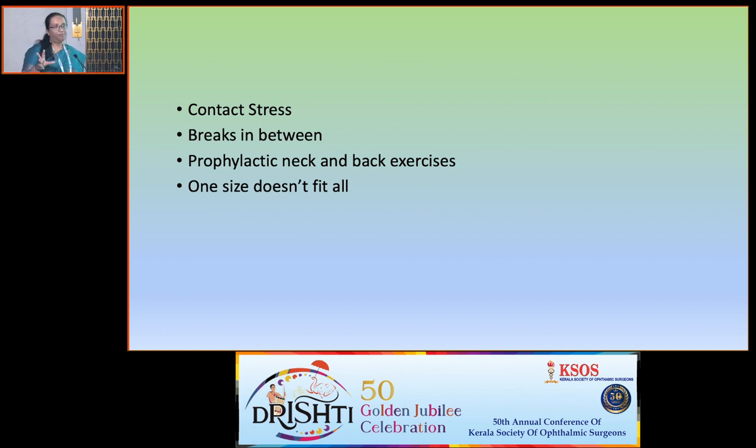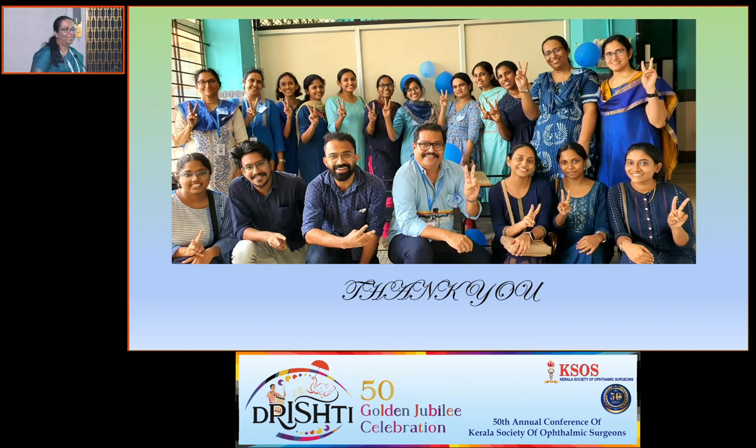And one thing is, since we are really promoting the industry, we can say that one size doesn't fit all. We have tall ophthalmologists, we have short ones. We can have different types of instruments for us. They don't have to give you one slit lamp and then we have to adjust it. We can tell them that we need different designs, depending on you. Thank you so much.